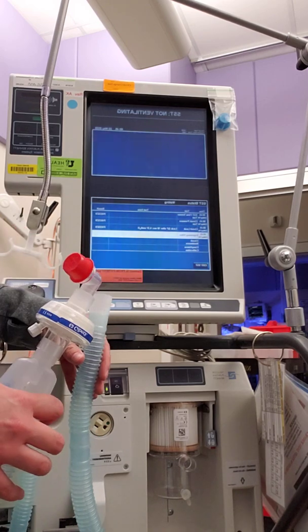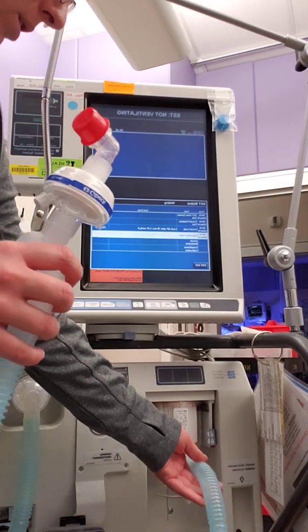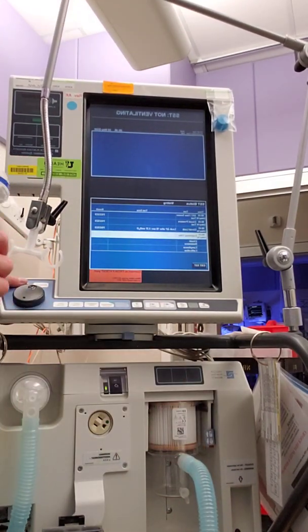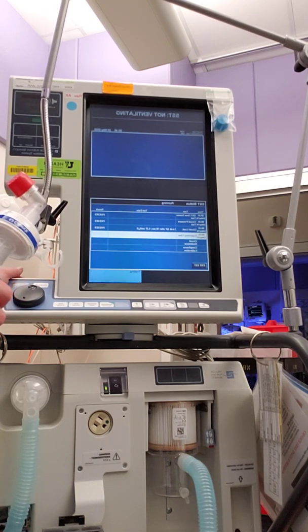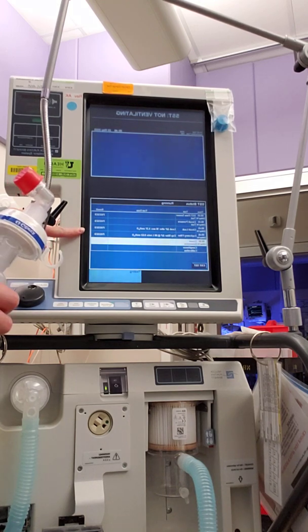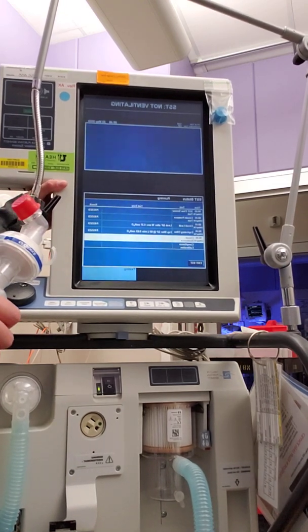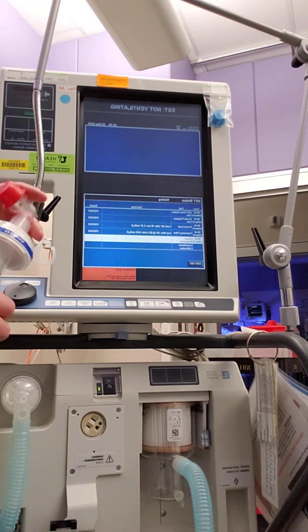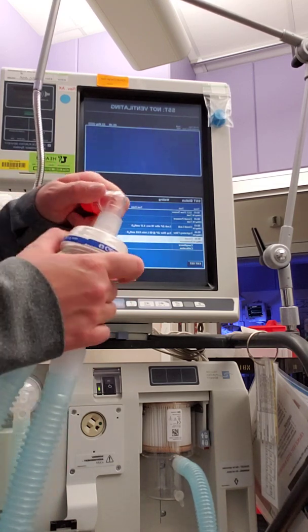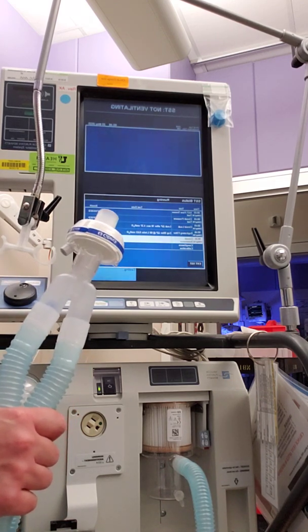And it's testing. Connect to from patient port. So we're coming from the patient. We're testing here again. And then we press accept. Okay, we have passed. We're now checking our circuit resistance. Okay, and now it says to unblock the Y, so we take this off. And now we press accept to move on to the next step.